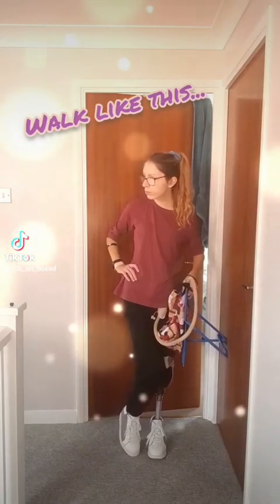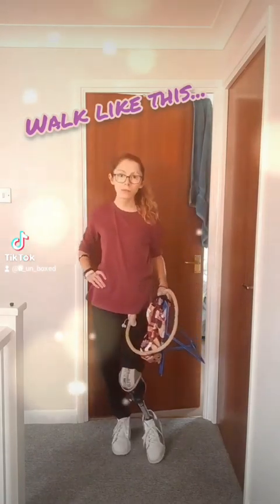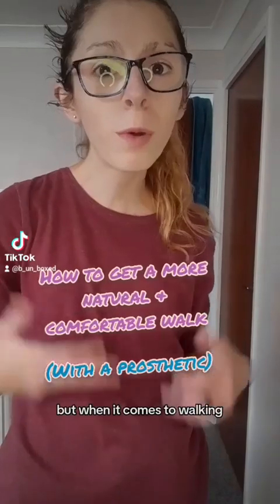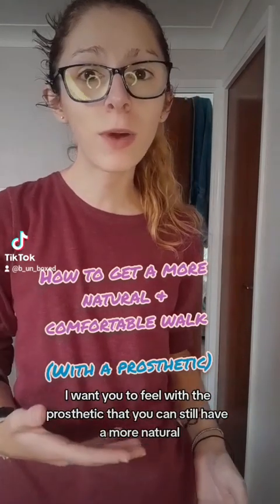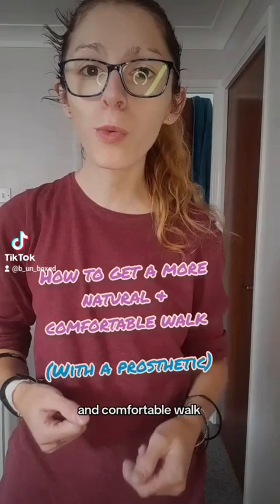All the pretty girls walk like this — for the record, I am just kidding. But when it comes to walking, I want you to feel that with a prosthetic you can still have a more natural and comfortable walk.